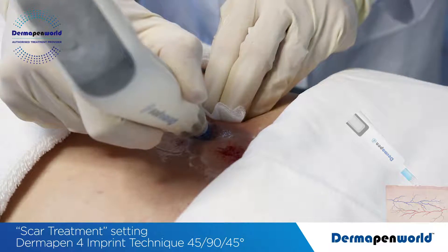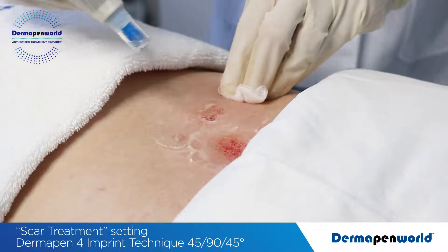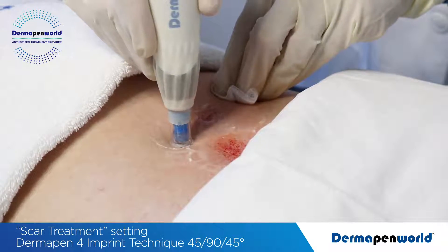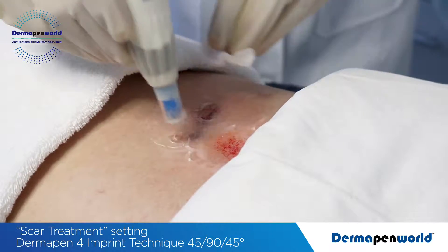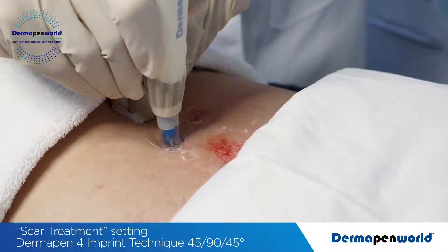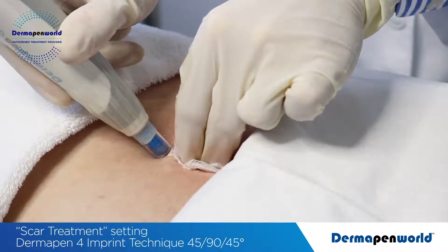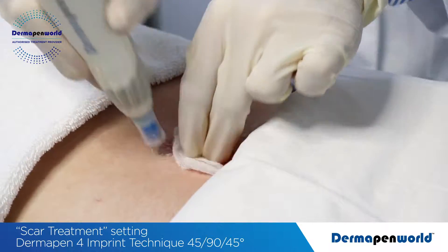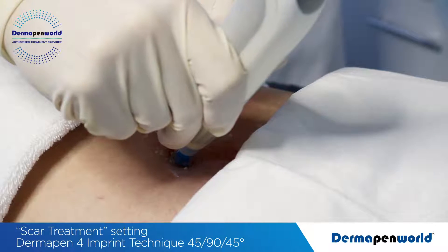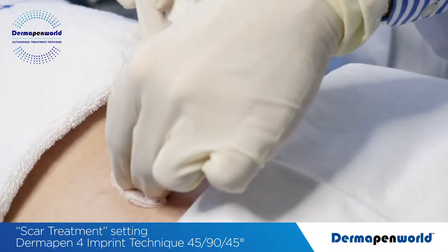Again, we go for our desired visual endpoint of pinpoint blood. Now onto the second scar. At a 90 degree angle, using your gauze to support the skin if required, and then at a multiple angle — 3-4 seconds — and simply hold the Dermapen into place using an imprint technique when not stamping.